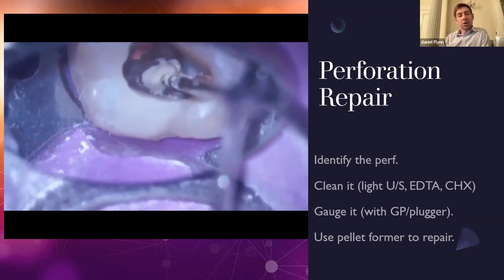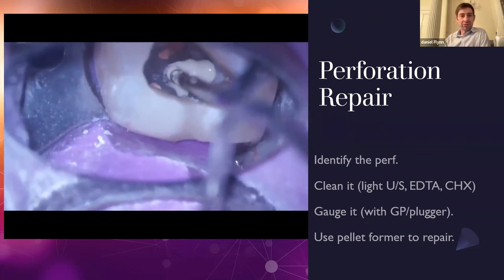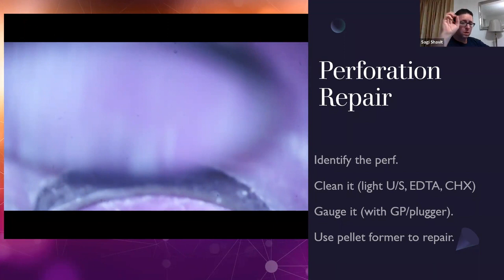Yeah, the reason I like that putty, I've used so many of the different putties, is that you can just work. You don't have to just sit back and wait. I just used to get so frustrated with the longer ones. Exactly. This is a film, I think, from 2-3 years ago. I was showing a perforation to somebody. When you're using the pellet former, you place the material exactly where you need it. You don't need to block any canals or anything like that with paper or GP points. And if you're using bioceramic putty, which has a high washout resistance, you can continue work.